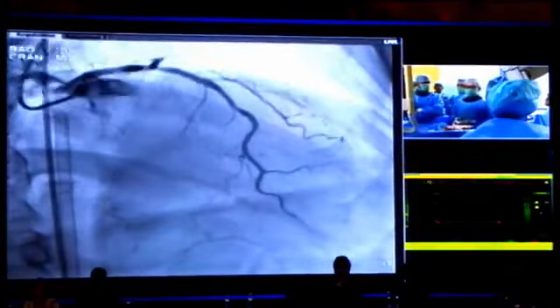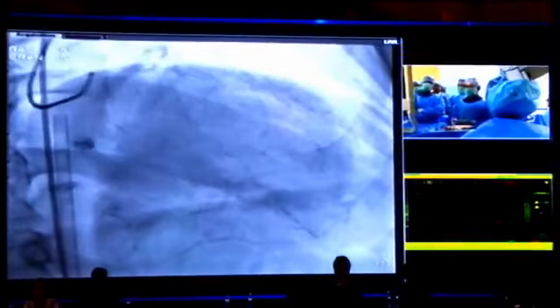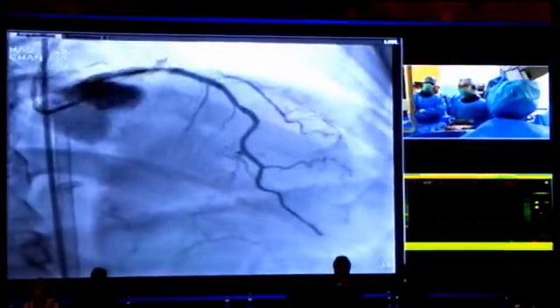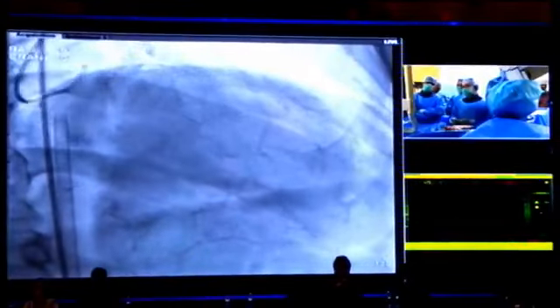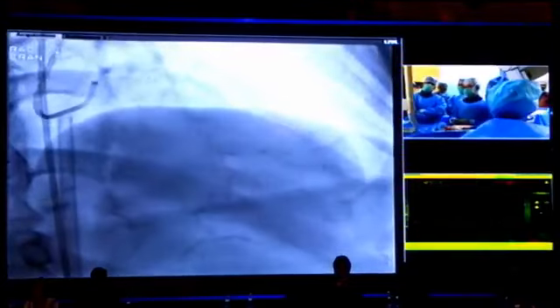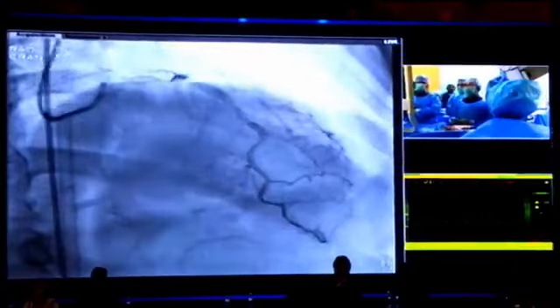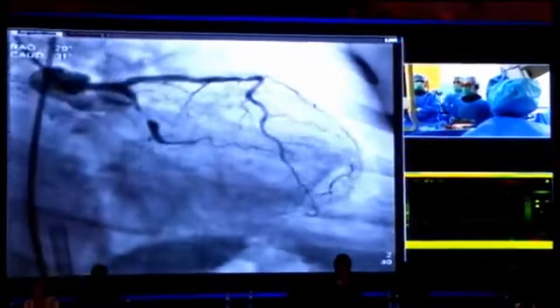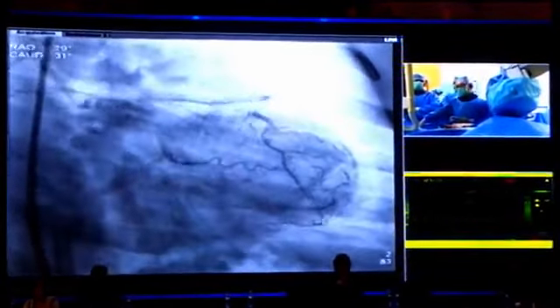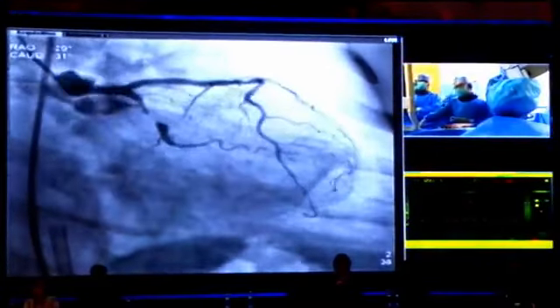I will show today's angiogram, and this is the cranial view. As you can see, a stent is already placed in the LAD, and the stent status is quite good. We can see a little collateral from the diagonals. The proximal and distal diagonals seem connected to the distal part of the circumflex. This is the caudal view. We can see the CTO lesion at the distal middle part of the circumflex, just branching to the small PL branch.